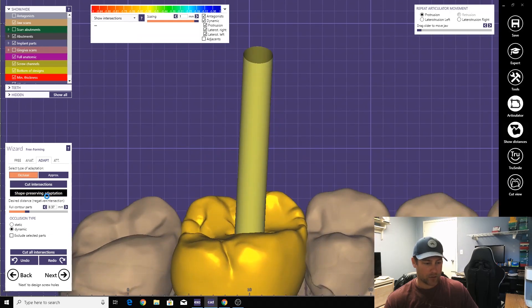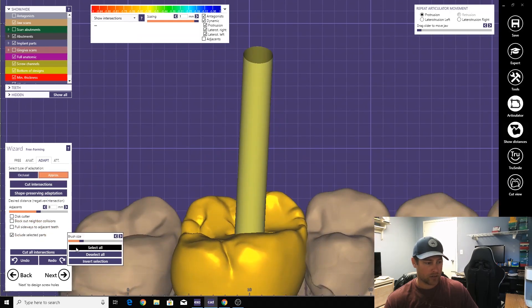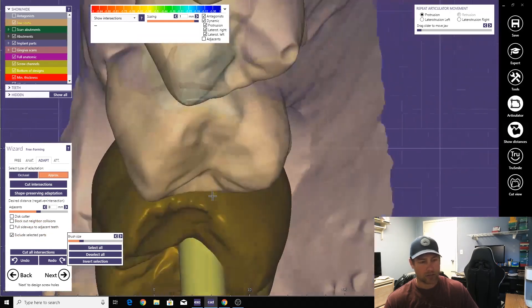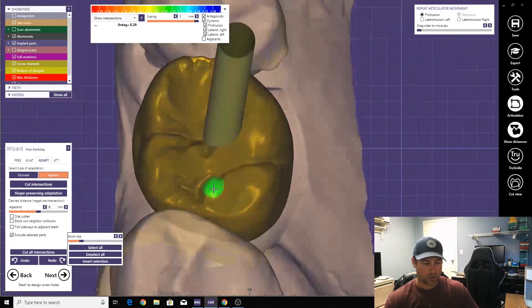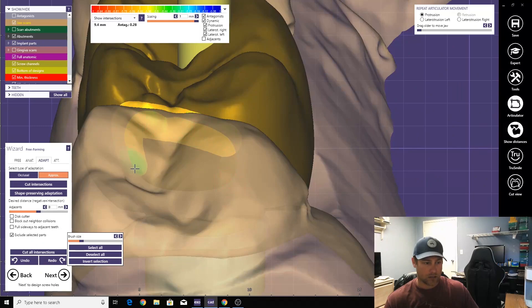And then we'll cut and do contact. Nice broad contact area. And then lastly, what we definitely don't want is undercuts with the screw channel.